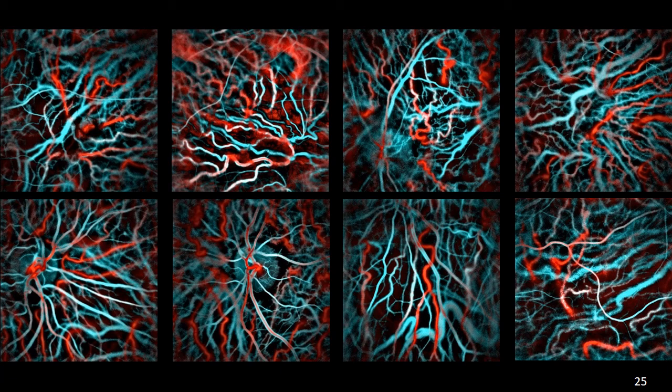Okay, and just a few examples in health and disease, well, mostly disease, I think, probably mostly AMD. Well, what you can see is that the differentiation of artery and vein in the choroid is very robust.